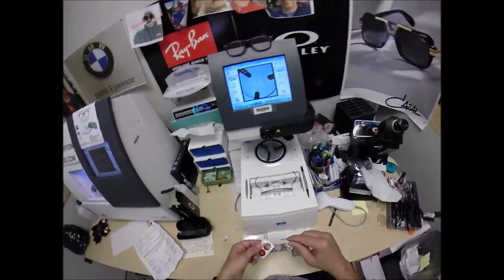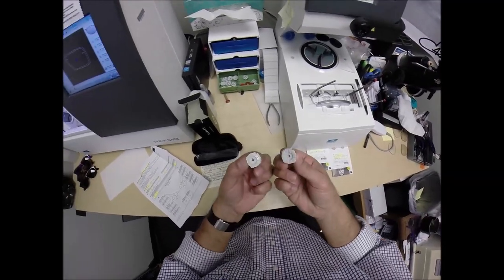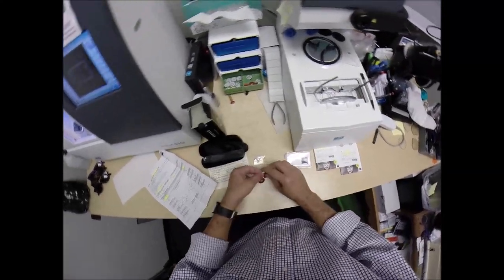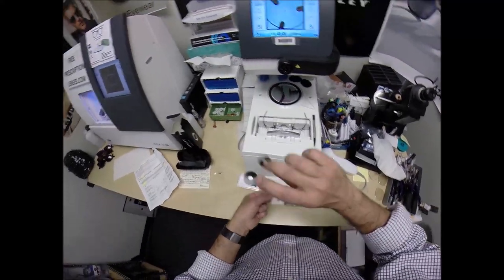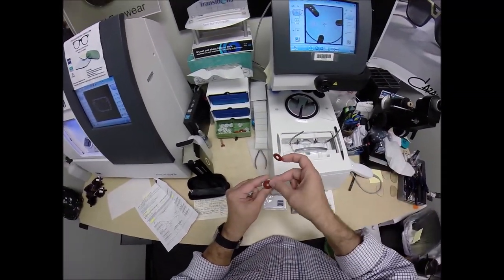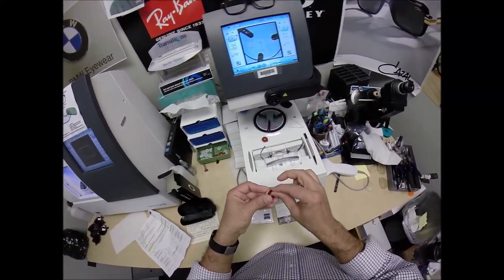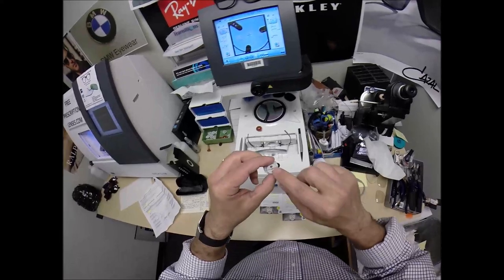So, I need to attach two blocks to your lenses, or as I like to call them, Jenny from the block. I have two double-sided adhesive stickers, of which I have here. The black side is the sticky side. Stick that one onto the first one. Do the same thing now for the second one. Pull the paper away to make the black side sticky.